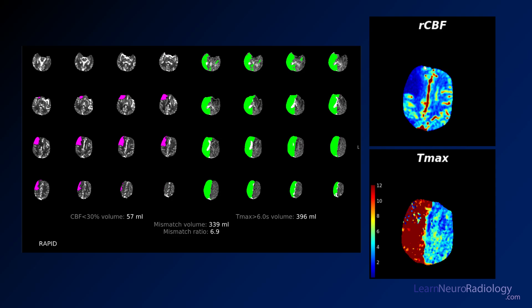Here you see these blown-up images showing the same thing — loss of blood flow in this right frontal area, but the T-max is very elevated throughout the entire cerebral hemisphere.